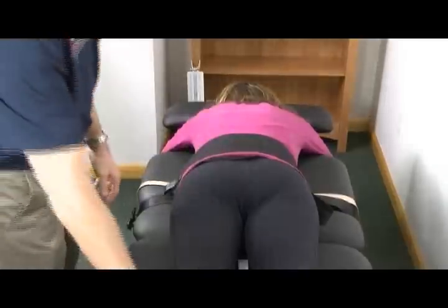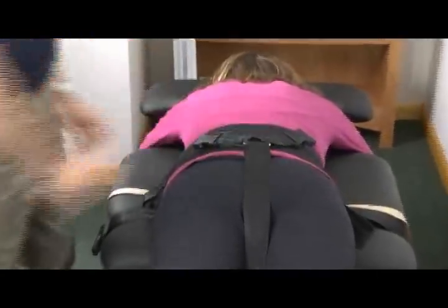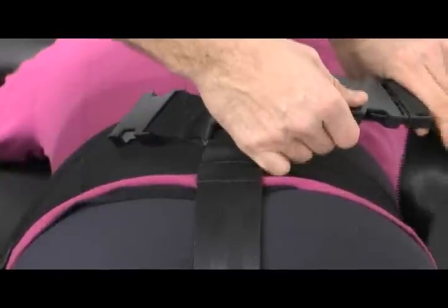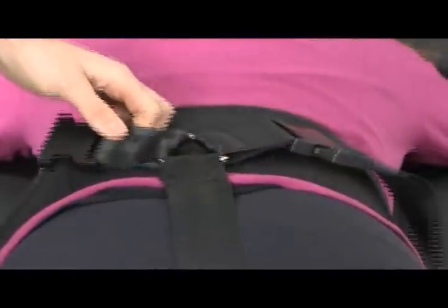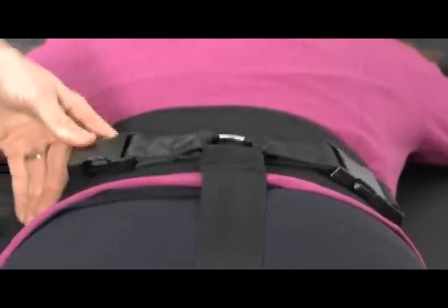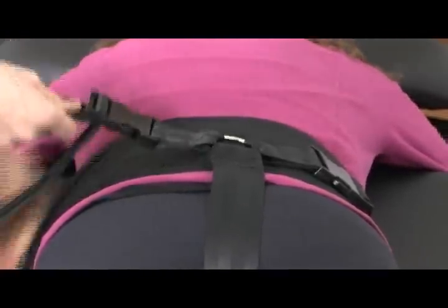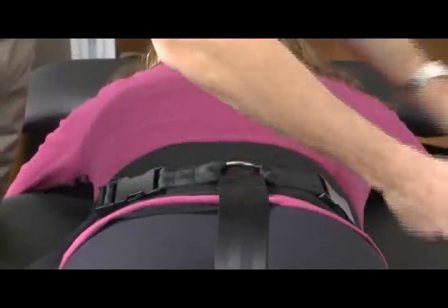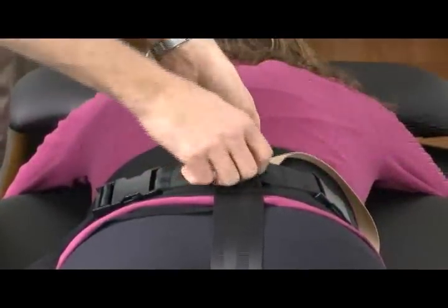Complete the abdominal wrap as shown and engage the velcro enclosure. Connect the lower belt clips together with the upper circumferential belt as shown and pull down on the tightening strap until snug. Engage the ring loop retention strap and tighten snugly.